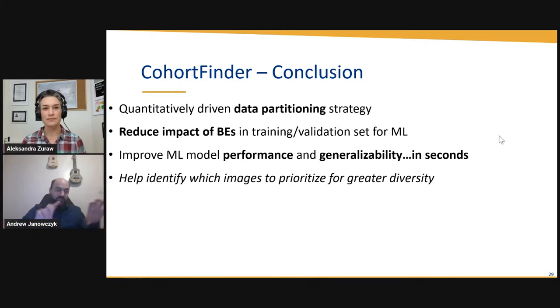It'll find you all of the different diverse batch groups. And the solution to optimizing your time is to pick just one from each of those groups and say, these are the ones that you should start by annotating. And if you say, I'm only interested in doing five of them, pick the ones that are most separated from each other on the plot. And now you have the most diverse examples, so when you build a model with those, it's much more likely to generalize across a larger space in that deep learning solution space.